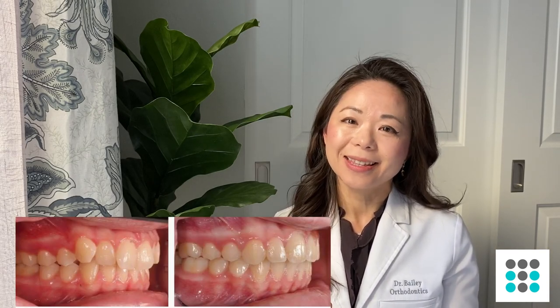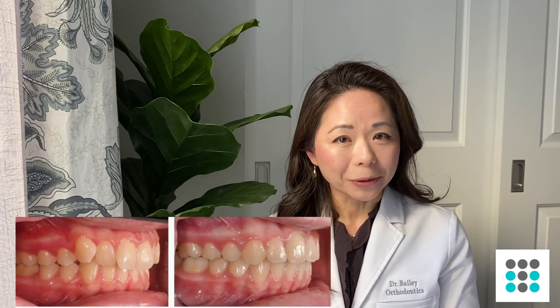So rubber bands — what they're for. Rubber bands, they correct your bite usually. That's usually what they're used for. Aligners, clear aligners and braces, remember they align your teeth only. They align your top teeth, they align your bottom teeth, but it doesn't correct the relationship between your top and bottom teeth. A good bite is an ideal position of the top teeth and the bottom teeth so that they fit together properly.